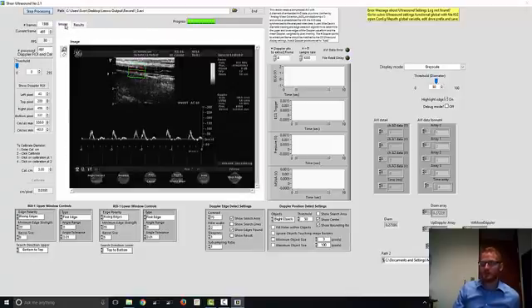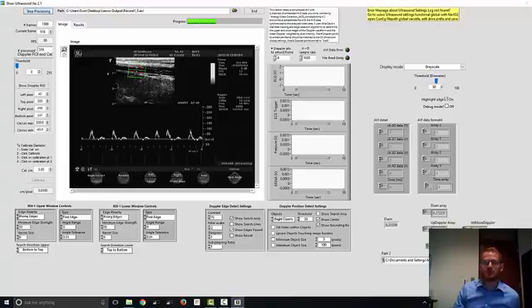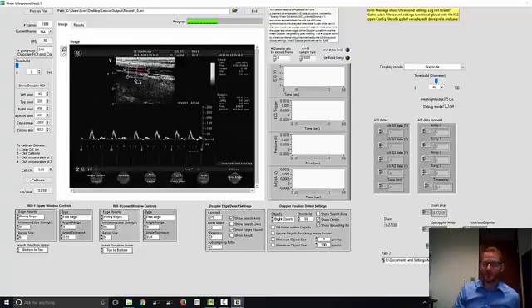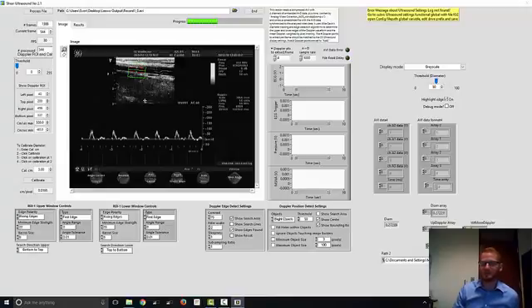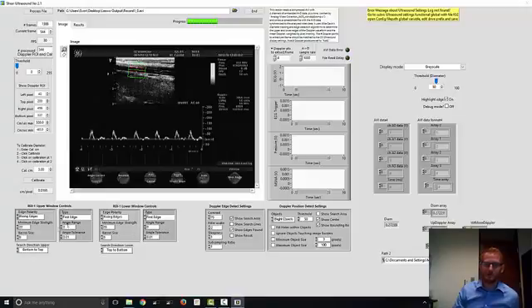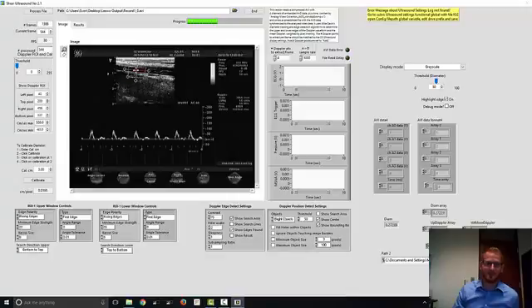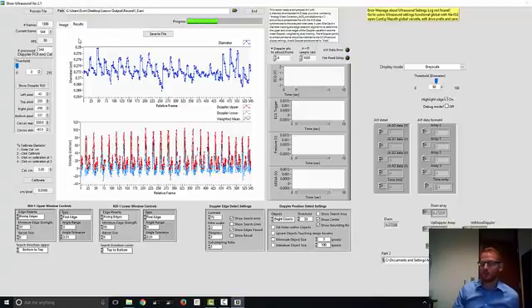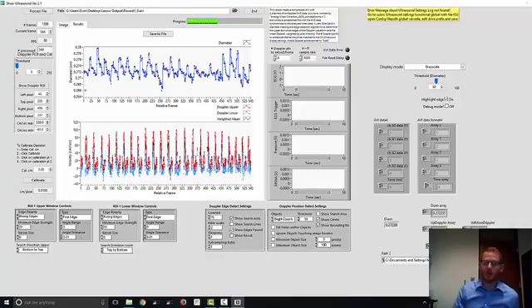While you're analyzing, if you ever see an issue, let's say you lose the vessel wall for some reason, you can always hit stop processing. You want to do this minimally, but you can adjust this box a little bit. You can shrink it in to get it off some noise. You could move it to a different location, but you're going to get different values if you do that. So you really don't want to, unless you absolutely have to. But you can also adjust these minimum edge shrinks for the upper and lower as you're going, if need be. The best method is to do it as little as possible to make it stay on the vessel. Because anytime you adjust any of this, you're going to get slightly different values, and you want to avoid that if you can. At this point, I'm going to stop this because we don't need to run through this whole thing, because I already have this analyzed.